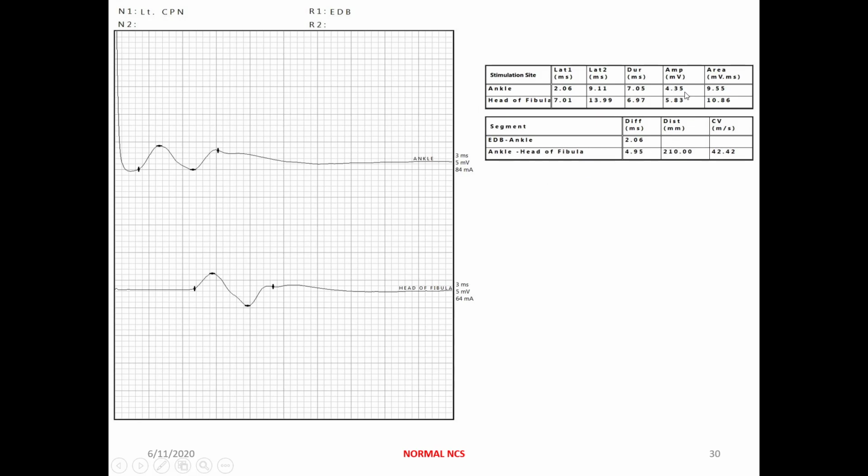Okay, fine. Now just by the side you can have area also. Area means whatever area is occupied by this rectangle, that is formed because of joining of all these 4 markers, that will be area, but that will not be having any clinical significance. So we don't need to concentrate on that. Now, this was assessment of first CMAP that was measured at ankle. Now the same is for at head of fibula. Everything latency, amplitude.